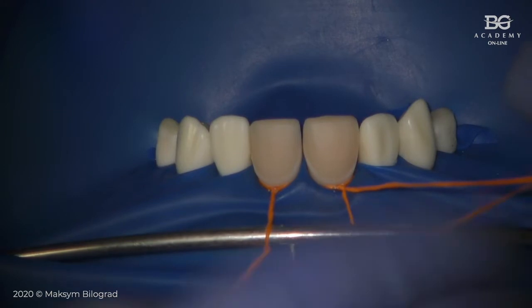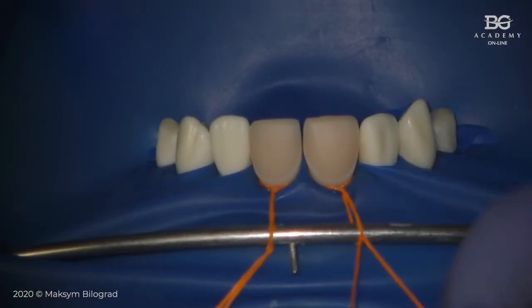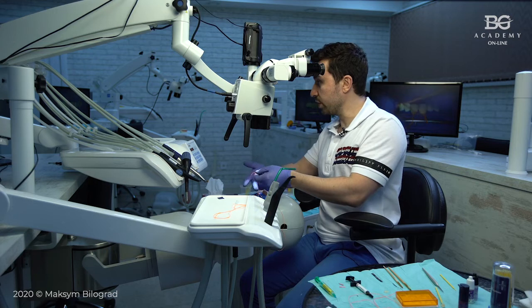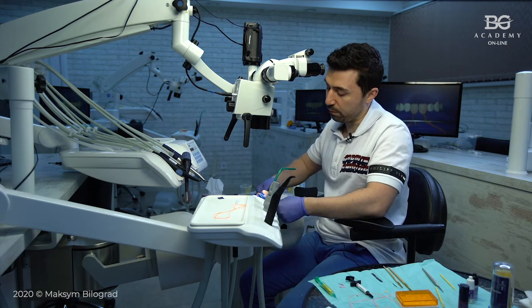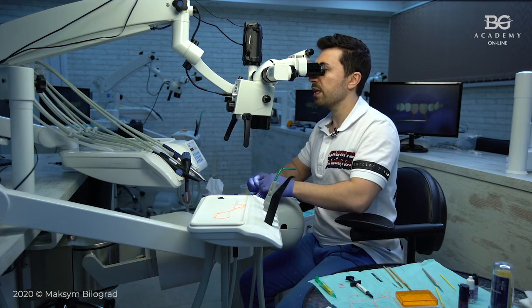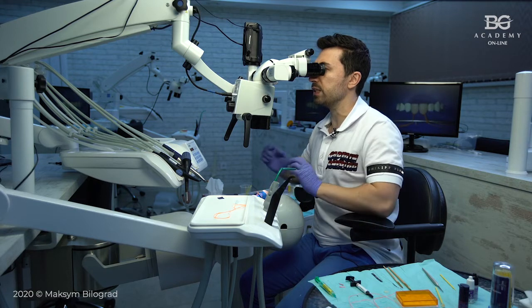And then I would like also to say that another tip with that type of isolation is not to cut these free floss ends. Don't cut these free floss ends. Keep them, okay? They will be really helpful for you when you will do finishing and polishing process after you will cement all of your veneers.